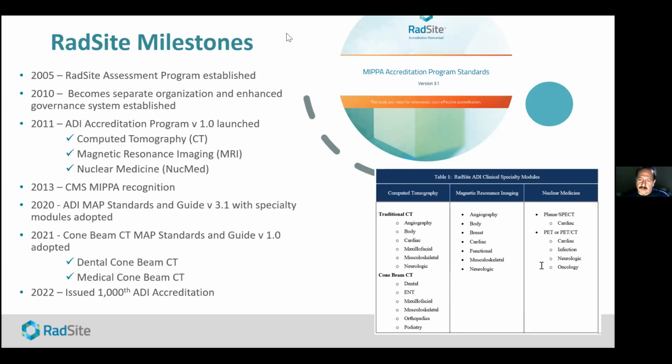Also, we've got the capability of reproducing images with a 3D perspective. And another advantage, which is also true of traditional CT, is being able to make very precise measurements. When you have conventional X-ray, any measurements that you make are subject to a magnification effect. And if you don't know exactly how far the patient's tooth or feature or implant is from the detector, it's impossible to get precise measurements.